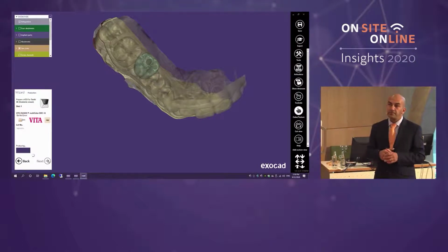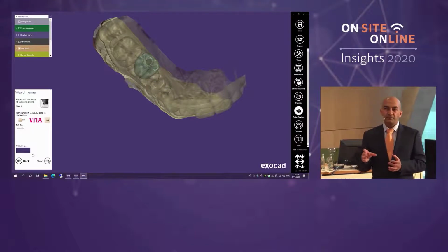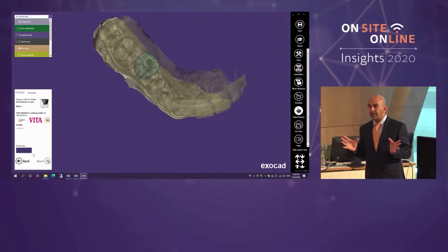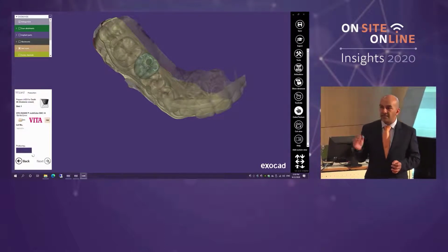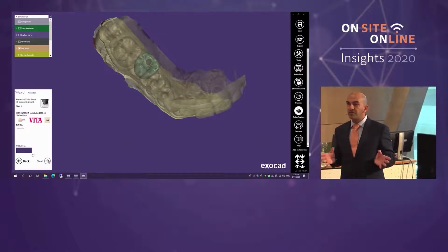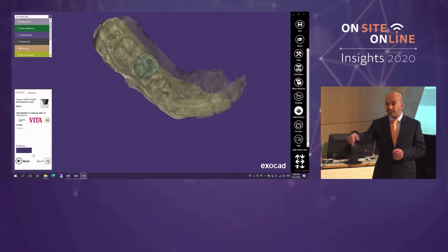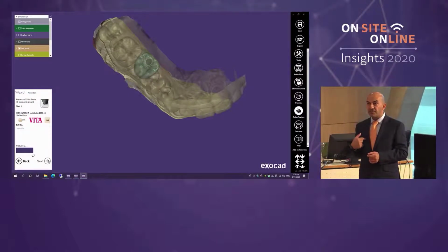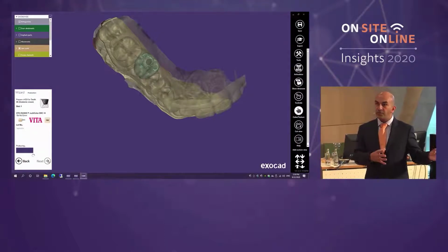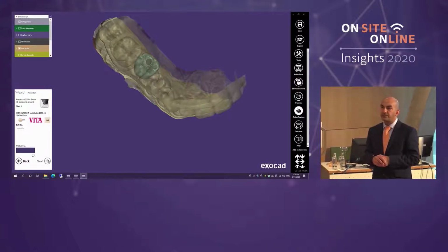So your lab gets the funny stuff or the fun stuff? The lab gets, look, the experienced works. My lab is called 4D ceramics, okay? The 3D part of it is 3D CAD CAM. The fourth dimension is the technician. I have absolute respect for my technical colleagues. Really, really important. And saying that though, my technician and his wife, both of them have restorations that I made for them chairside. So just like they appreciate what we can do with technology, I appreciate what he can do with his hands.